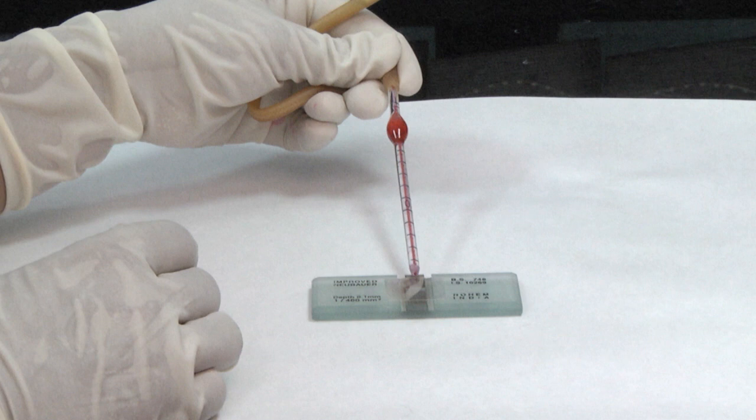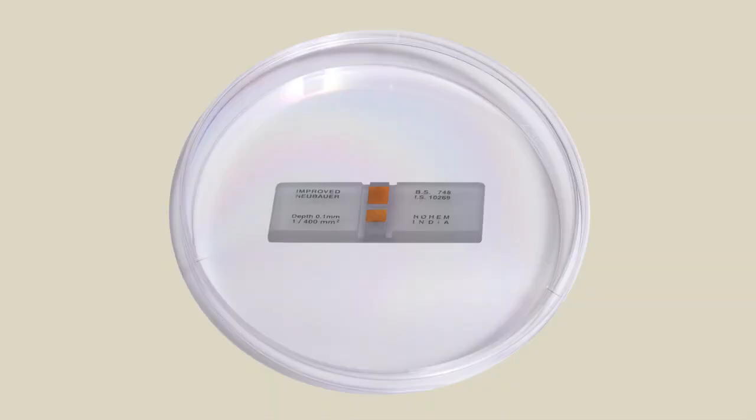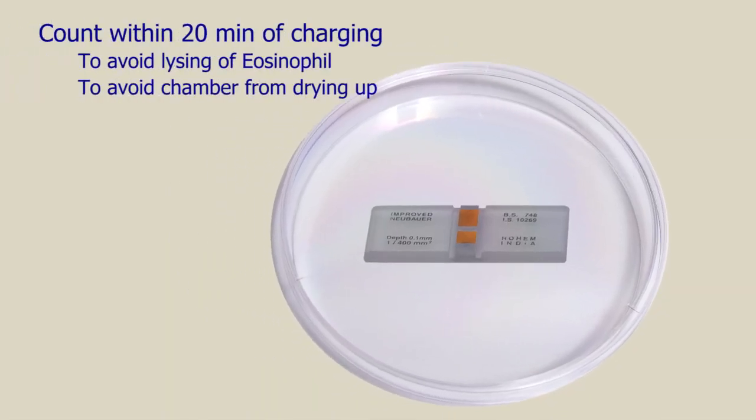Charge the counting chamber by allowing a small drop of fluid to form at the tip of the pipette and gently bringing it into contact with the edge of the cover slip already placed on the chamber. After charging, time should be given for the cells to settle down, but counting should be started before the fluid begins to dry up.